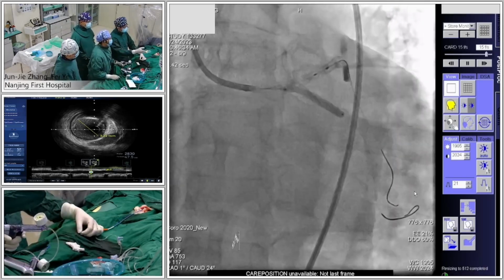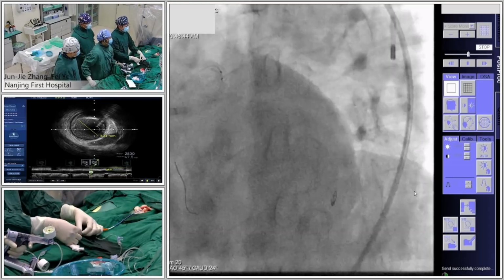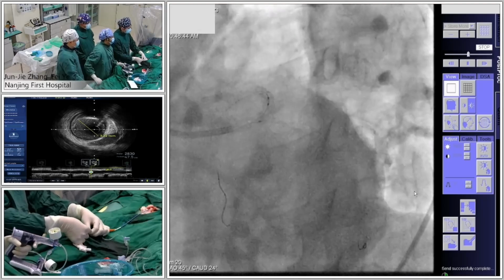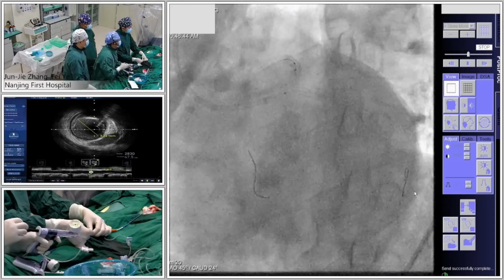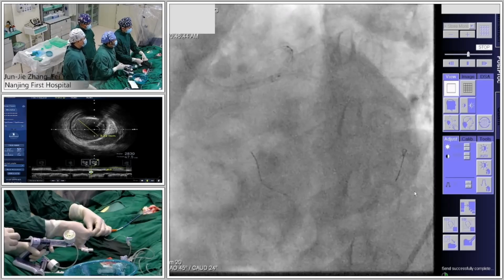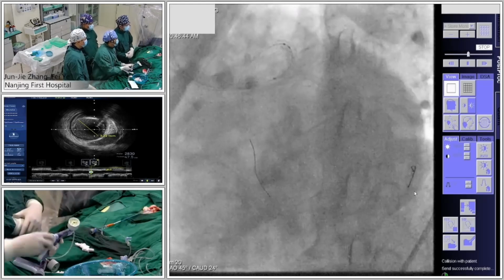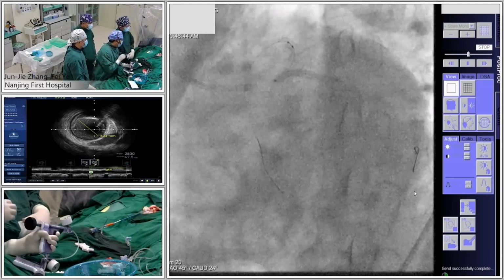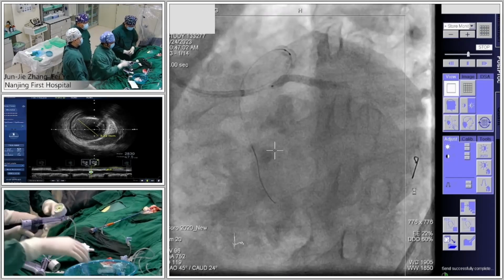At the same time, there is a spider view, with an NC balloon at the main vessel. After that, we make sure of the side branch stent optimization with a stent balloon. Yes, okay, stent balloon. Put it back. You use the stent balloon to do the post dilation at high pressure. 12, 14. 14. Okay, done. Looks good.